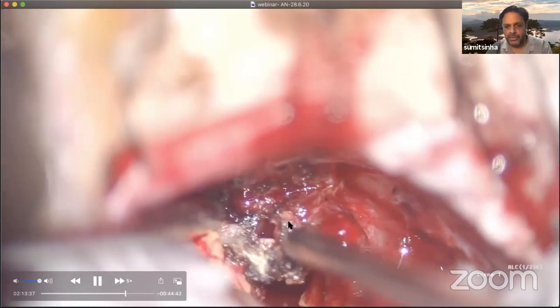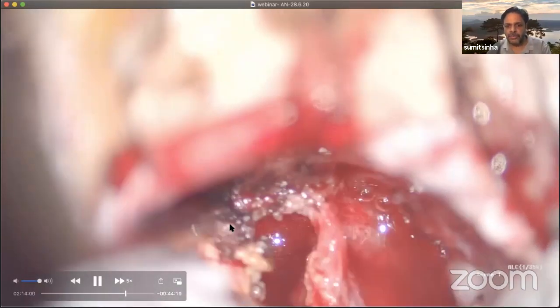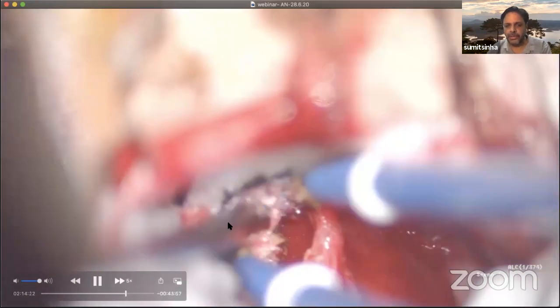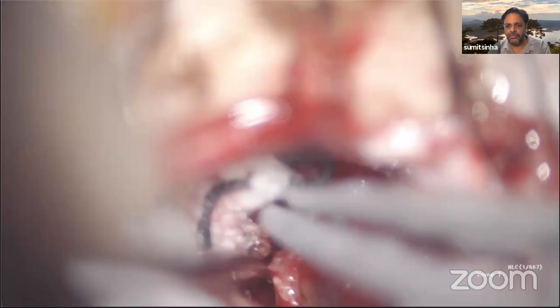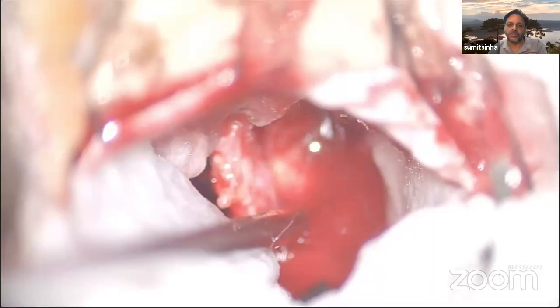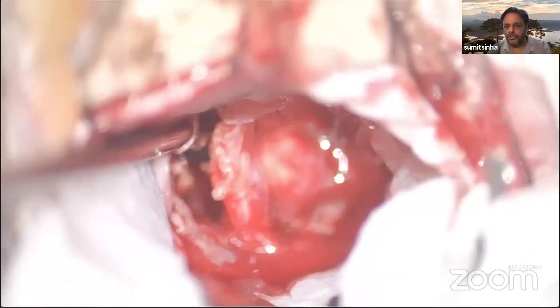Removing the entire thing. Now here I'm safe. The facial nerve is not going to come over the superior part, the lateral part of the porus. In the medial lip of the porus, I have to be very, very careful about the facial nerve, but there is no vital structure in the lateral lip of the porus. So I can freely take out the tumor tissue from here.